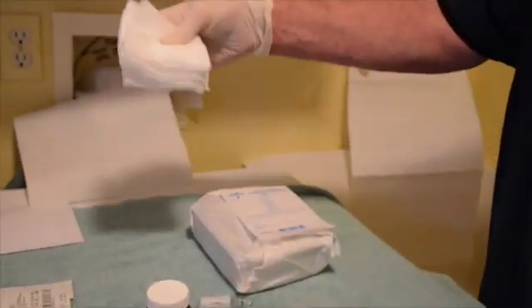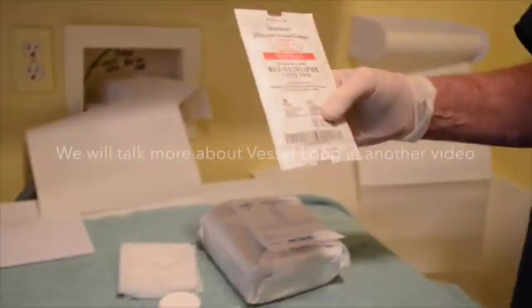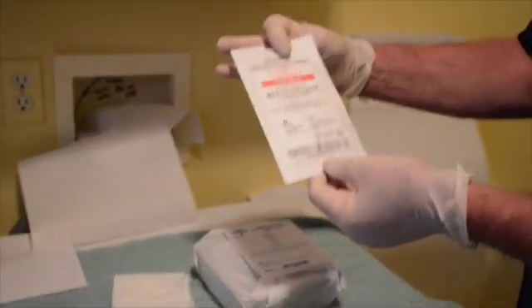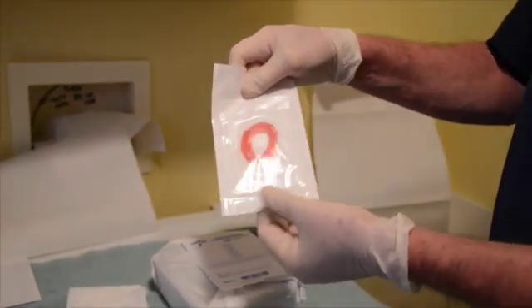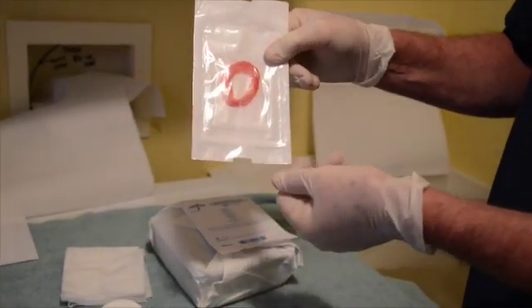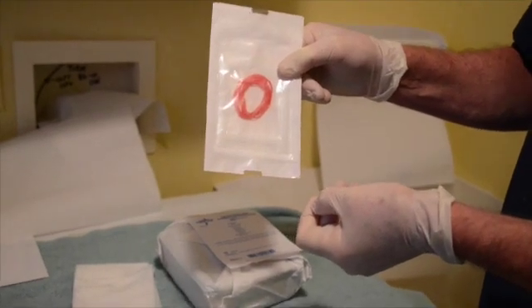Some 4x4s to soak up the drainage. And this is a vessel loop, which is used in the operating room to identify blood vessels. It's a long plastic sort of string that is one way to drain an abscess without doing a big incision and drainage.